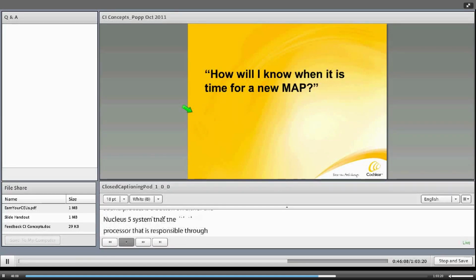How do you reduce the sensitivity with a cochlear implant? That is a button on either the sound processor itself or, with the Nucleus 5 system, that processor is adjustable through the remote assistant. And there is information on the Cochlear website. If you go in, there are troubleshooting sections where you'll be able to have a virtual processor and remote assistant available to you to practice and see which buttons have what capabilities.